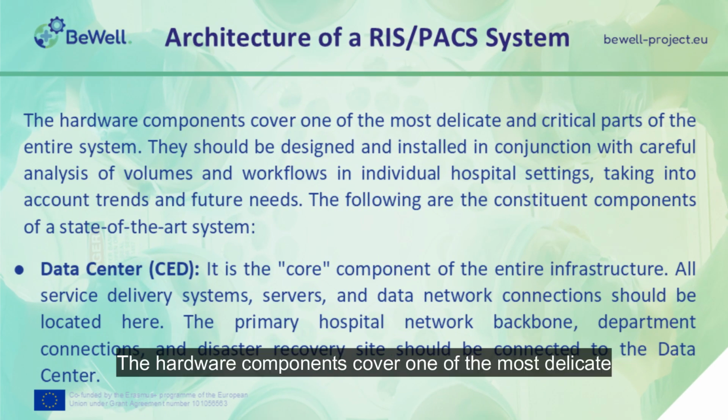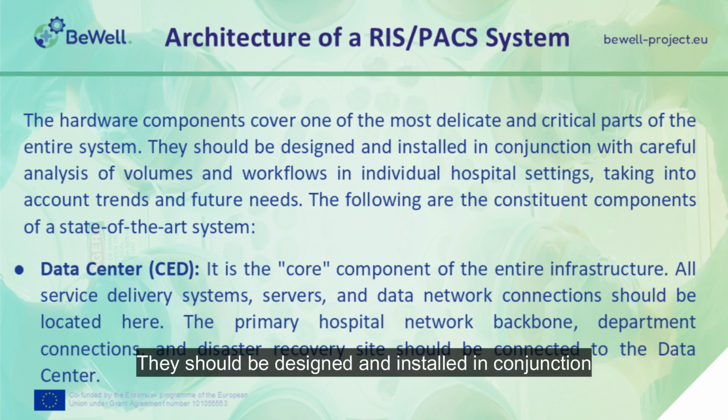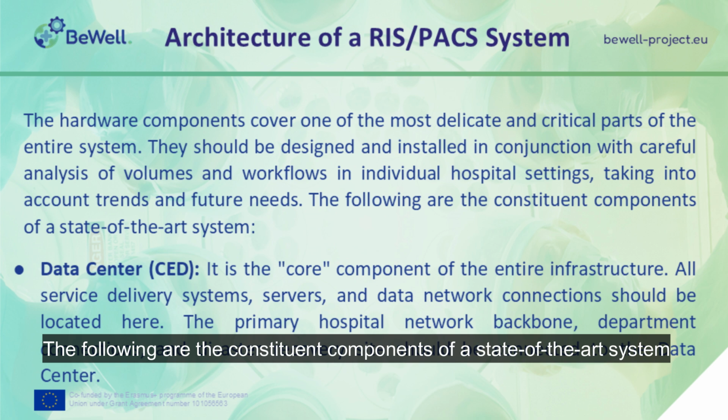Hello. The hardware components cover one of the most delicate and critical parts of the entire system. They should be designed and installed in conjunction with careful analysis of volumes and workflows in individual hospital settings, taking into account trends and future needs. The following are the constituent components of a state-of-the-art system.